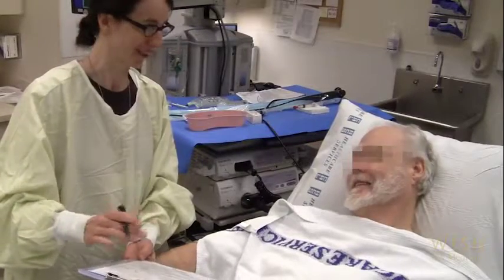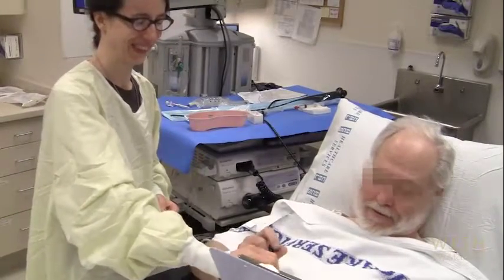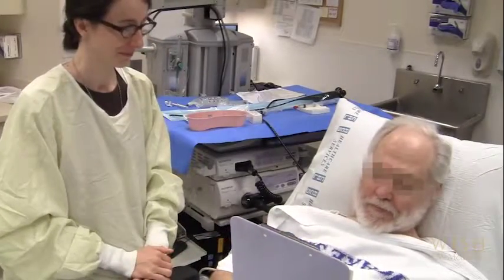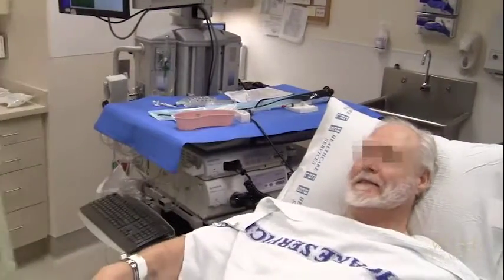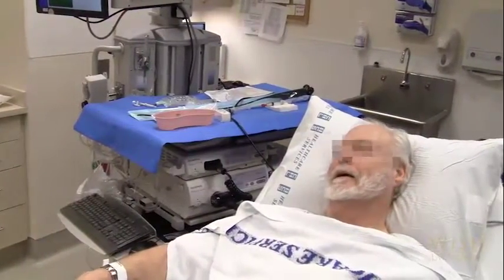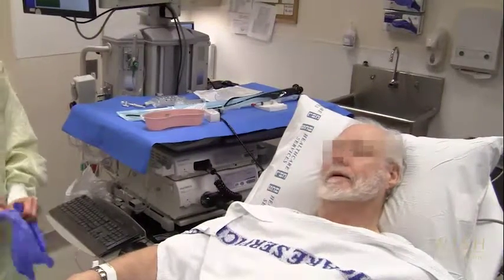Here is a patient being prepared for bronchoscopy. Telemetry, blood pressure, and pulse oximeter monitors are already in place. We recommend that you wear a protective gown, gloves, and a face mask when performing bronchoscopy and when numbing the airway, as respiratory secretions may be aerosolized during these procedures.